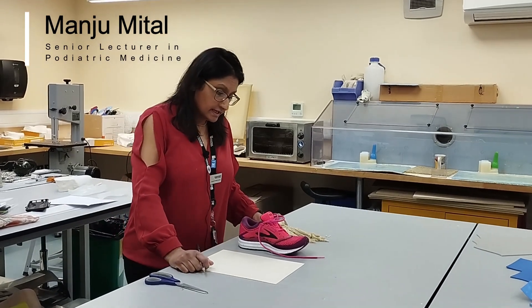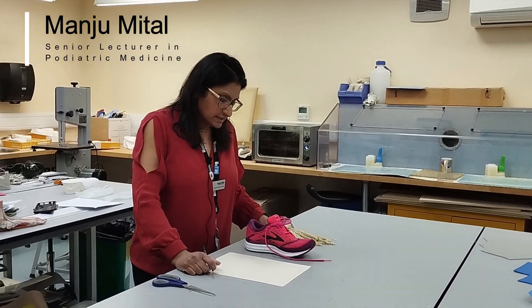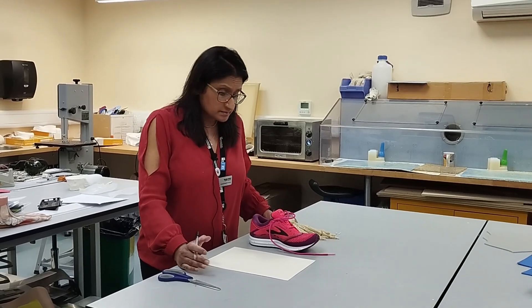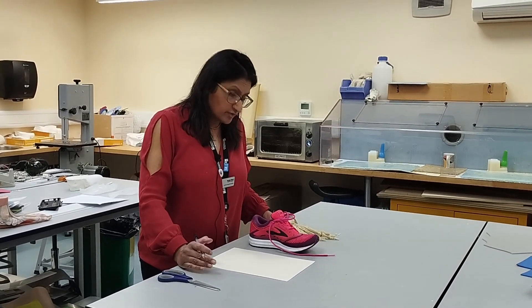What I'm going to show you today is how we would take a template in order to make a permanent insole or even a temporary insole from a patient's shoe.